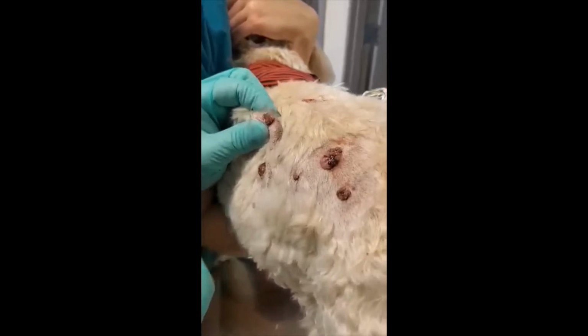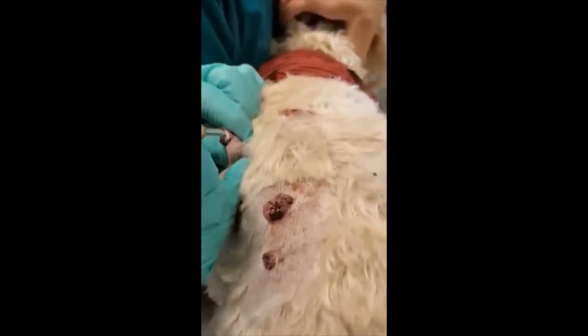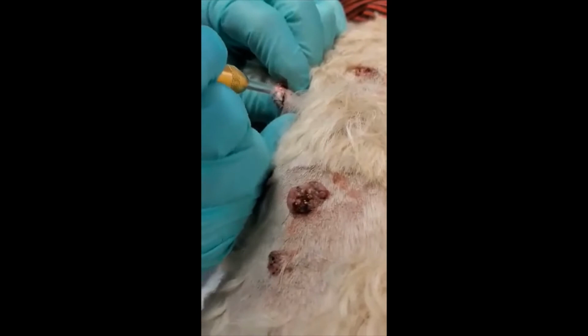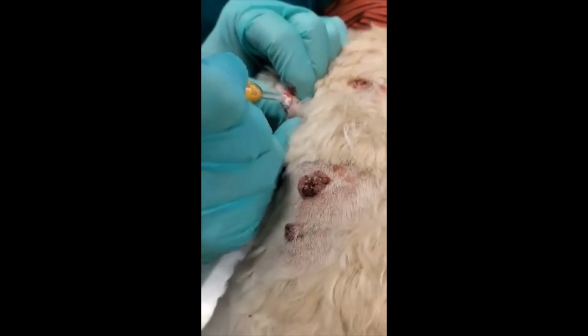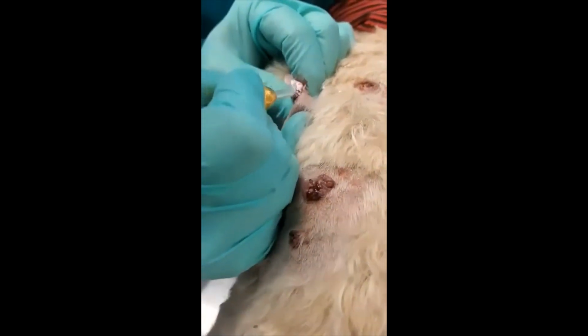So this is what the lesion looks like post-thaw. We're going to go ahead and refreeze these for 30 seconds. I find that the fleshy masses do require a double freeze cycle to cause complete regression.